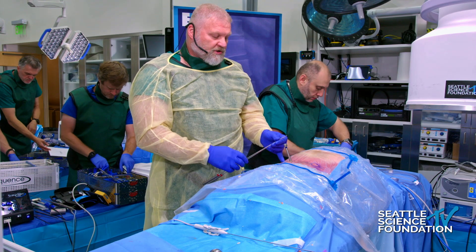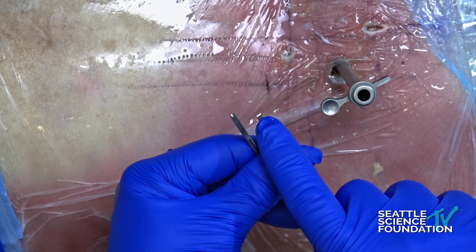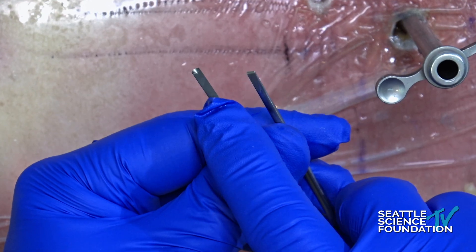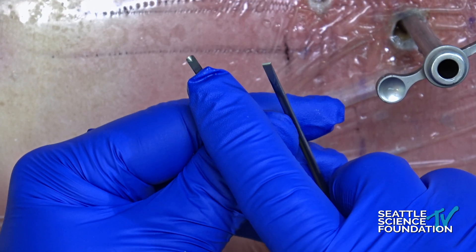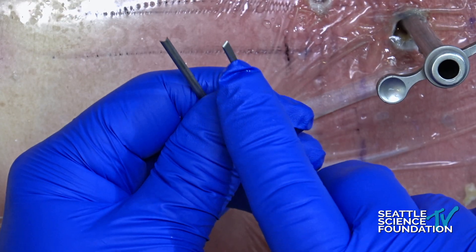So if you have an overhead view, I'll show you the tips of the things that are available. Basically there's a chisel tip, just like any other bone chisel, and there's a little gouge tip — kind of rounded. These are good for different situations.